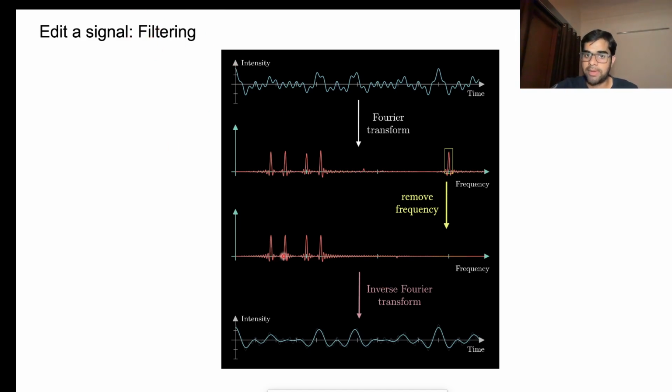You can also put a band pass filter, where you are not interested in very low frequencies or very high frequencies. Let's take a filter like this, where you draw a square and multiply, and you get only these three peaks, and that becomes a band pass signal of this particular signal. Depending on which frequencies you are passing, you call it a low pass filter if you're passing low frequencies, a high pass filter if you're passing high frequencies but not low frequencies, and band pass if you're passing certain bands, and you can define those values as you require.